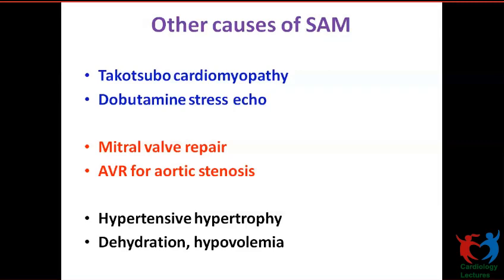So what is pseudo-SAM? And when do you get pseudo-SAM? Others can answer. Prabhavati is there. I know only few names. Ma'am, pericardial effusion, ASD, ma'am.